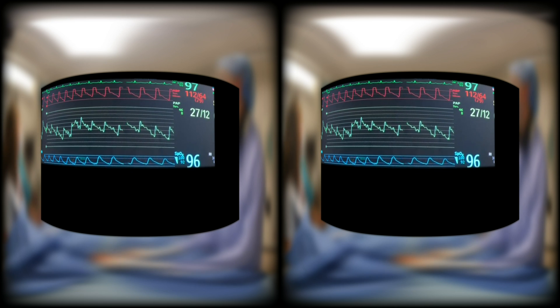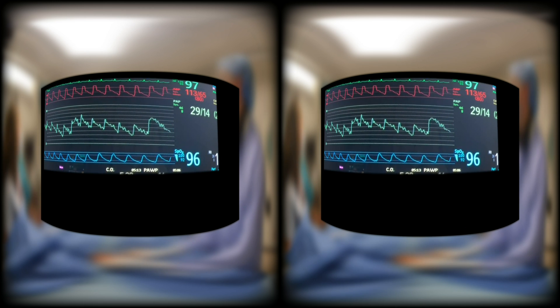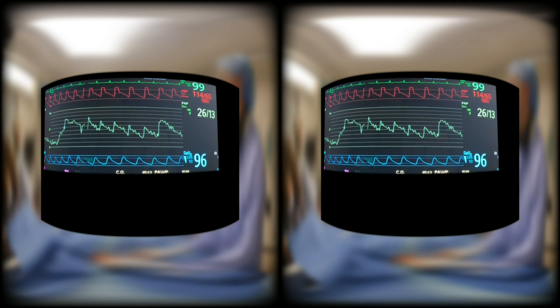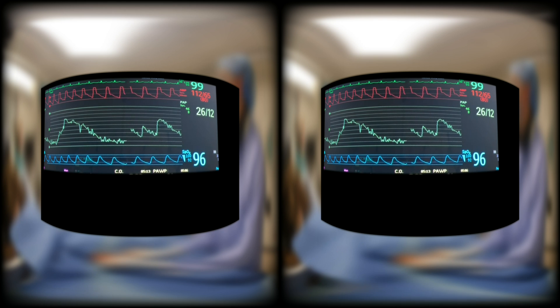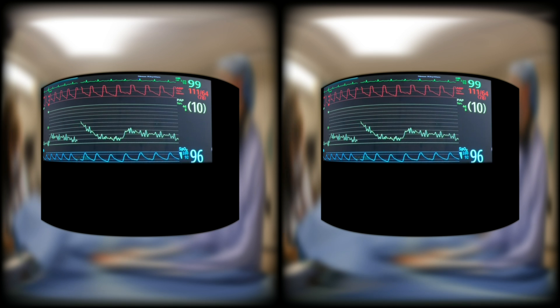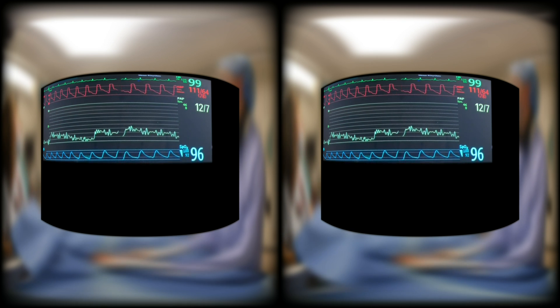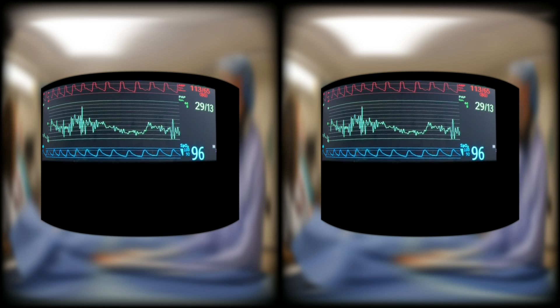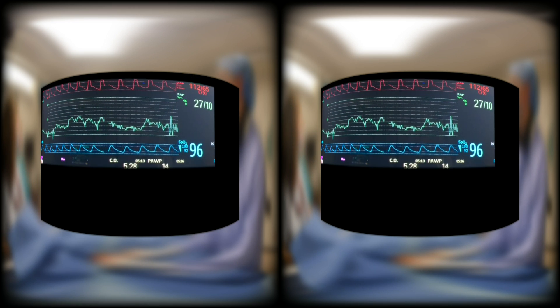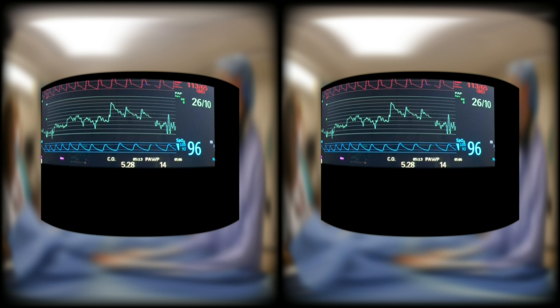Inside the pulmonary artery, you should slow down. When the balloon occludes the pulmonary artery, the catheter is now wedged. If you go too fast or push too hard, you can over-wedge the catheter. You will know when you have wedged the catheter when the waveform changes from a pulmonary artery waveform to a lower pressure waveform that looks much more similar to a CVP. You should never leave the balloon inflated for too long. Deflate the balloon and you will see a return of the pulmonary artery waveform.